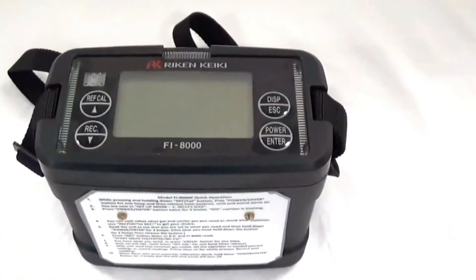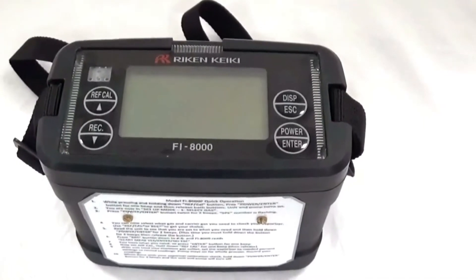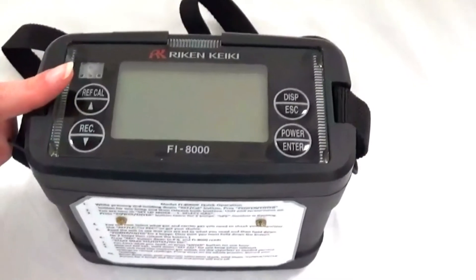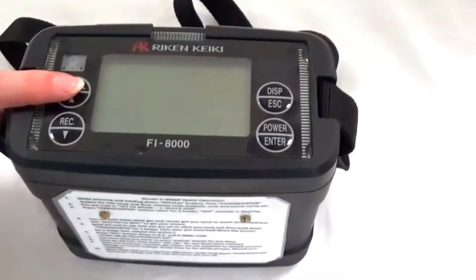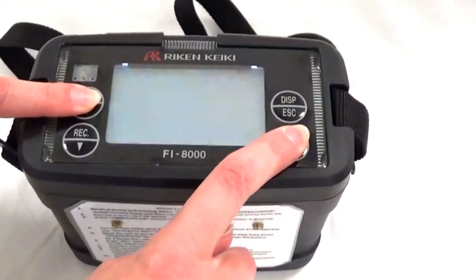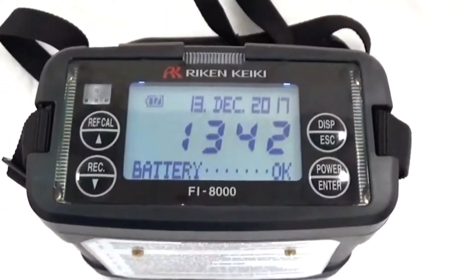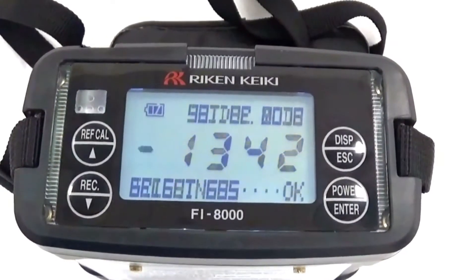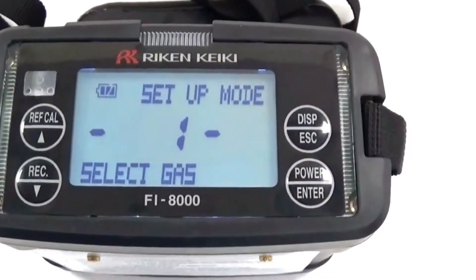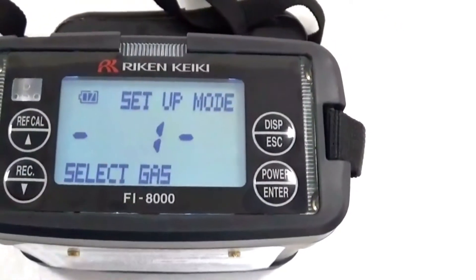We are now ready to turn on the Reichen Fi 8000 and get the air cal. To do this, we will press the ref cal button along with pressing and holding down the power button at the same time. The unit will flash red and beep, go through a couple of screens to make sure everything is okay, and then the setup mode screen will appear. We will now press the enter button twice.